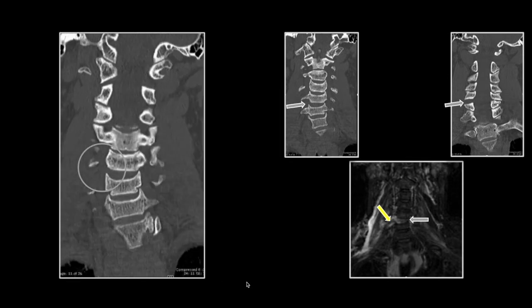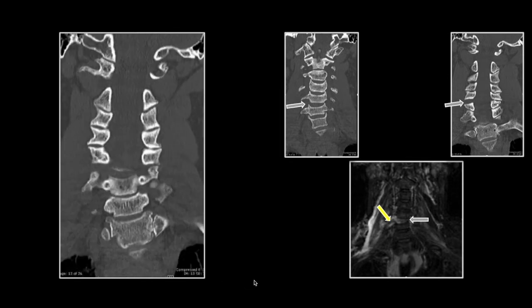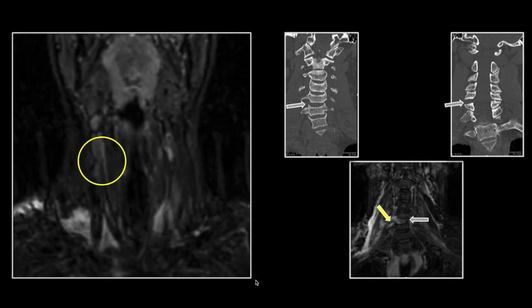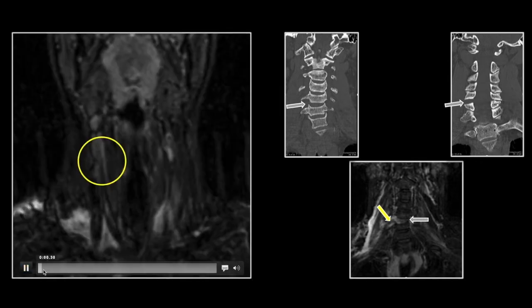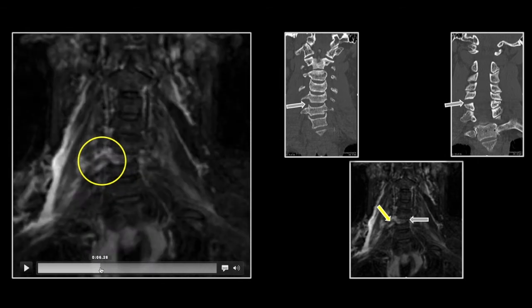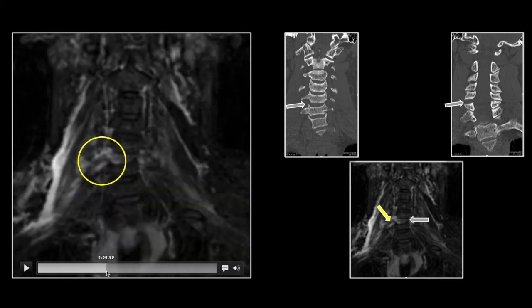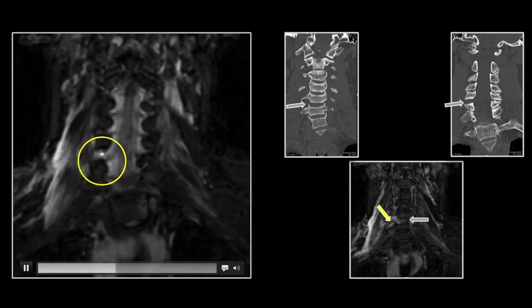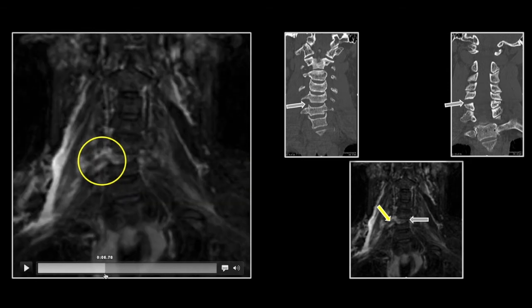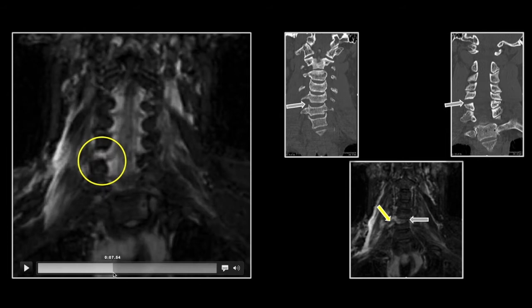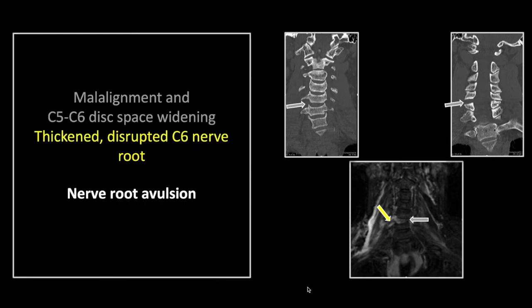This is an injury almost impossible to detect without the coronal views. Here we can track that thickened, disrupted nerve root — it is stretched, hyperintense, and thickened, most likely discontiguous at the level of the foramen. That is a nerve root avulsion resulting from a motorcycle wreck.